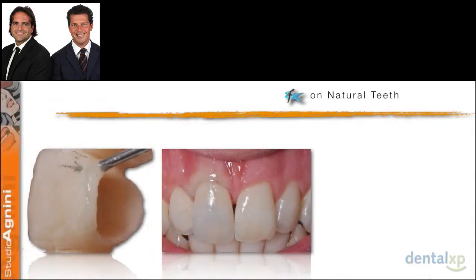The choice of the vertical finishing line permitted us also to treat the gingival asymmetries prosthetically, because while we were relining the temp, we had the possibility to add some flow, as you can see here in the arrow on the left picture, and then place the temp again in the mouth of the patient.